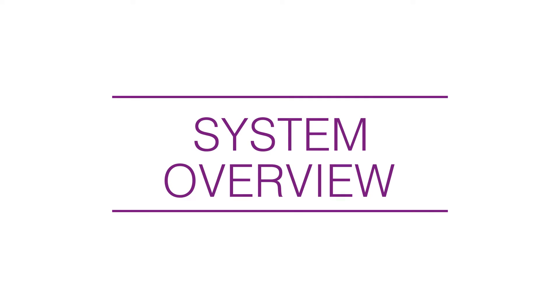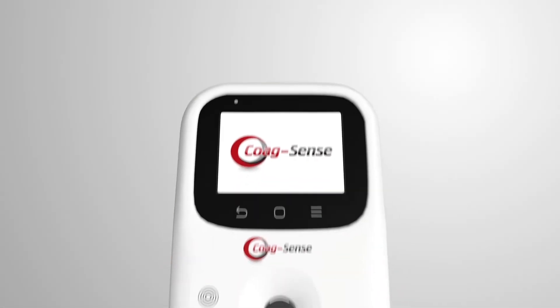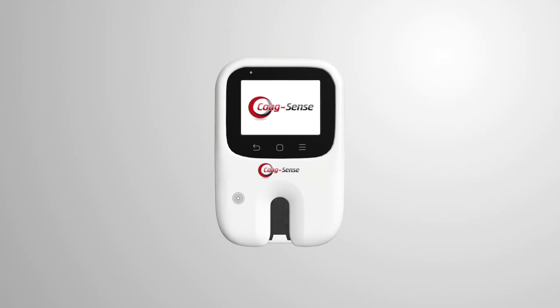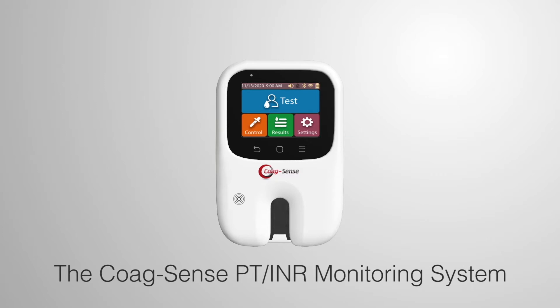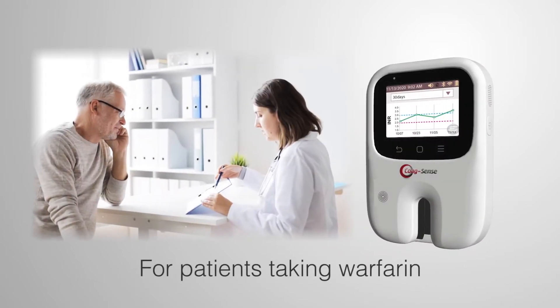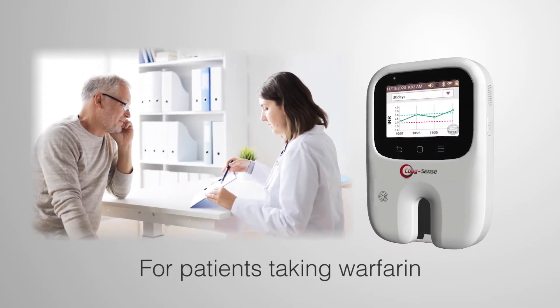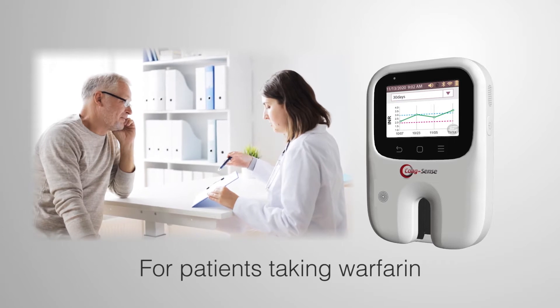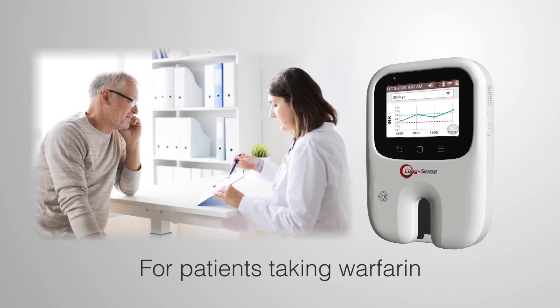Introduction and System Overview. Thank you for choosing the CoagSense PT-INR Monitoring System. The CoagSense system is used to test prothrombin time, PT, in patients taking warfarin for oral anticoagulant therapy.